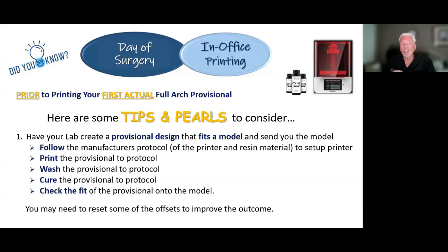You need to figure this out, because if you're thinking, oh, the lab's cutoff time is 1 o'clock, I'll get it by 3 o'clock, that doesn't leave a whole lot of time for you to do this if your print time is 90 minutes or whatever, regardless. These are things for you to think about. Do this ahead of time. I think this is a great tip. Again, kudos to my buddy Tremaine for making this comment. To me, that made so much sense. And it should be no problem for a lab to do that for you.